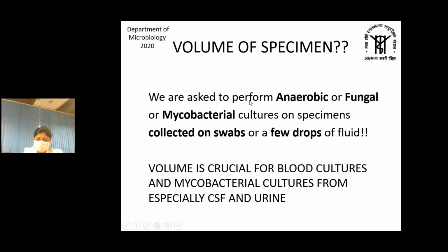Now, volume of the specimen. The first principle for collection of sample in the microbiology laboratory, as I mentioned, is asepsis, or least contamination from the microbial flora. For example, if I am collecting a blood culture sample, then I have to make sure that the skin is aseptically cleaned. Or if I am collecting a urine sample for culture, then I have to educate the patient regarding the value of a clean catch midstream urine sample.